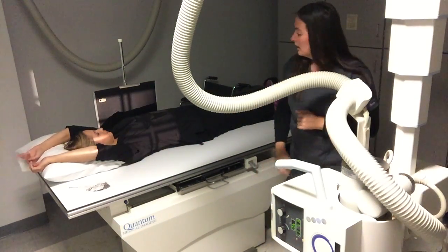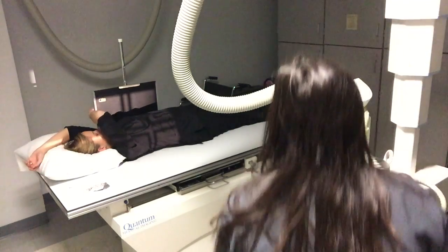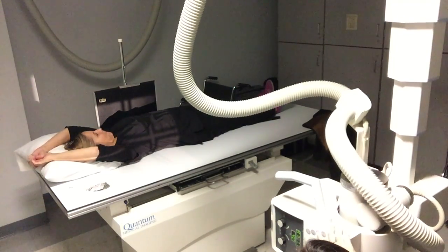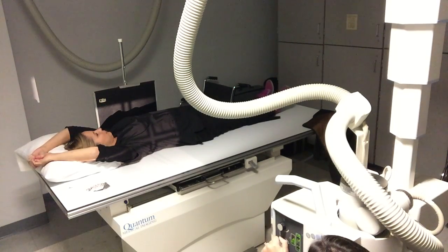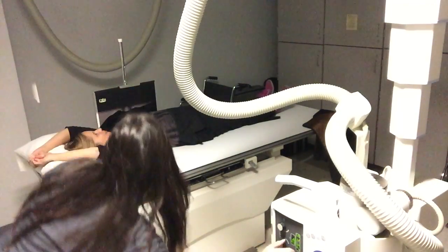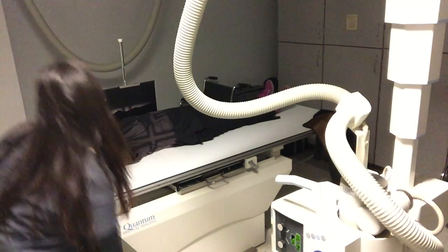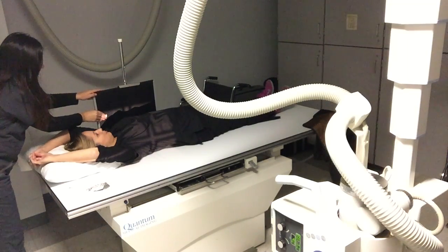I'm going to have her bring her arms all the way up and out of the lung fields. Now that she's turned I need to lower my tube down a little bit because I'm no longer at the midline, but I can leave my SID at 72. I'll come down to the midline and collimate in a bit more — which is what we like to see you all doing.